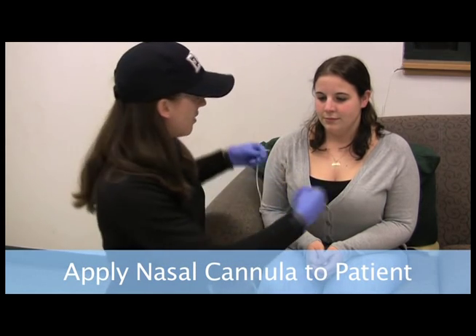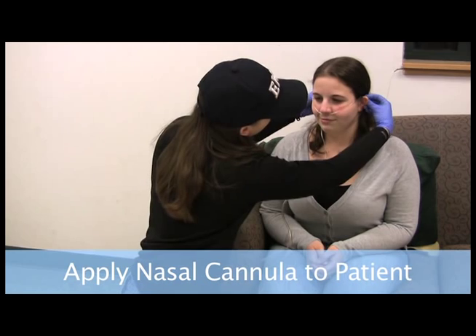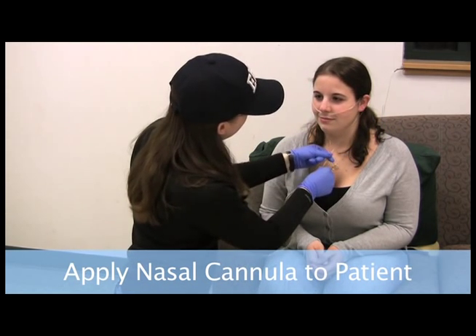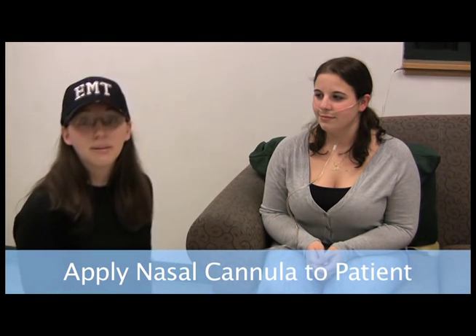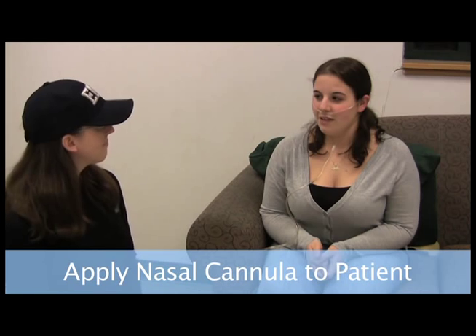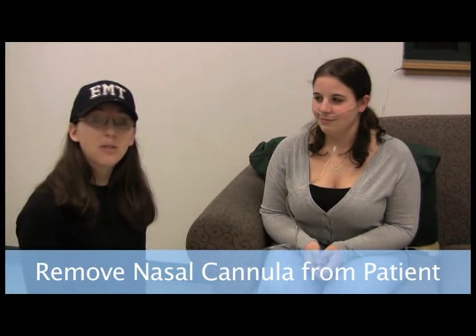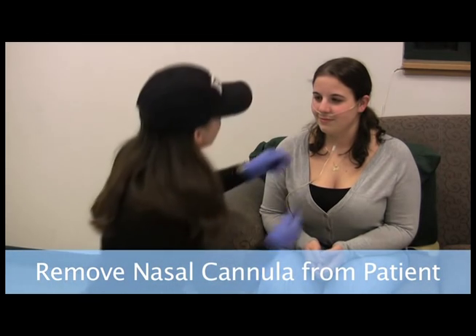How we apply this, it goes right into the nose, around the ears, and we can tighten it right at the neck. And that's how we apply a nasal cannula. I feel better. Oh, good. So she wants to go ahead and sign off, so we're going to go ahead and remove the nasal cannula.